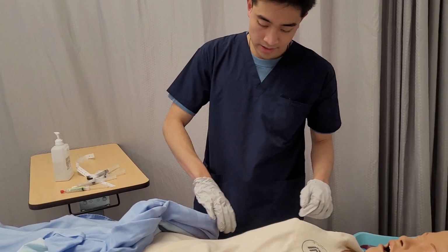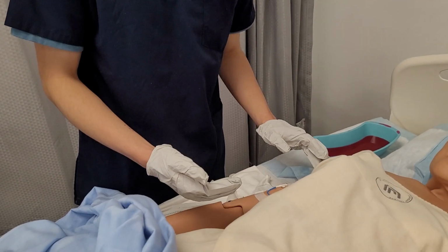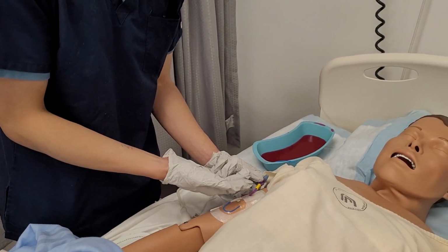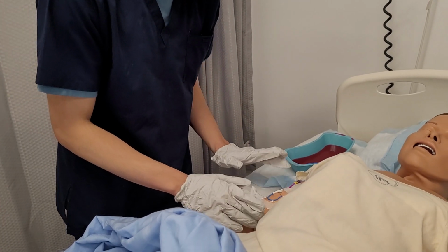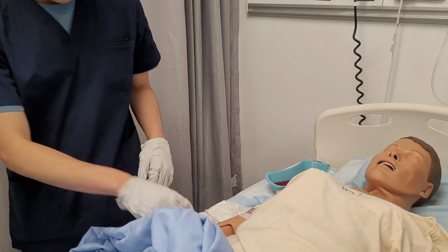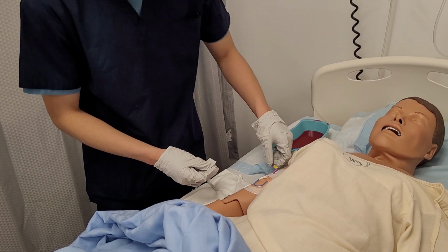All right, Pat, so before I give you the medication, I'm going to be assessing the site. I'm looking at the dressing to see if it's dry and intact. I'm also going to be assessing the PICC line, making sure there are no punctures or anything like that. I'm assessing around the skin, making sure there's no redness, bruising, or exudate present. All right. So the first thing I'm going to do is flush your PICC line, just to make sure that the lumen is patent.